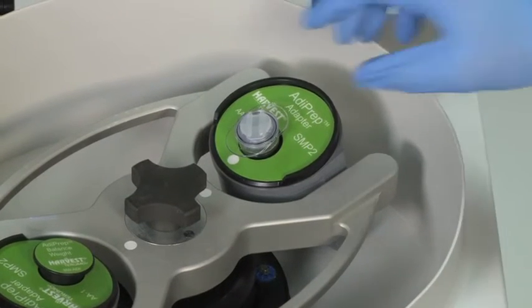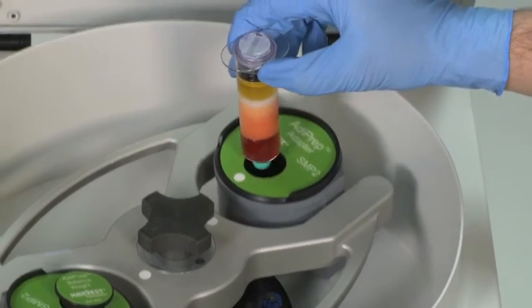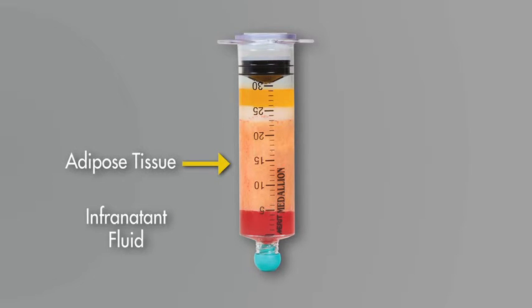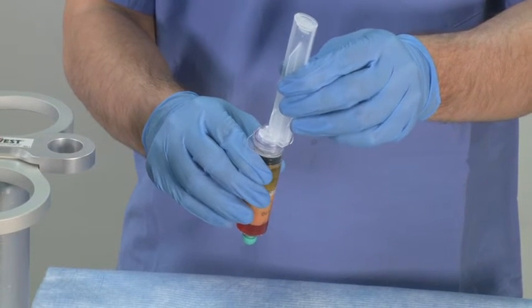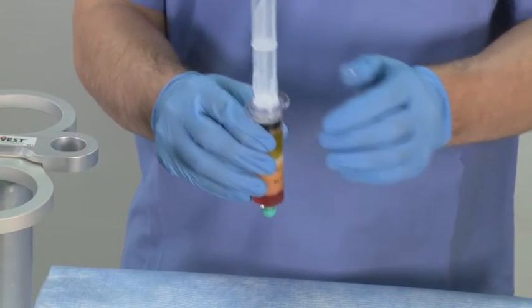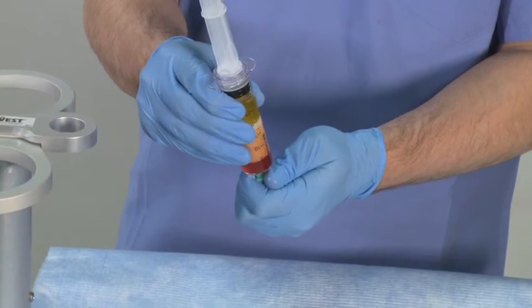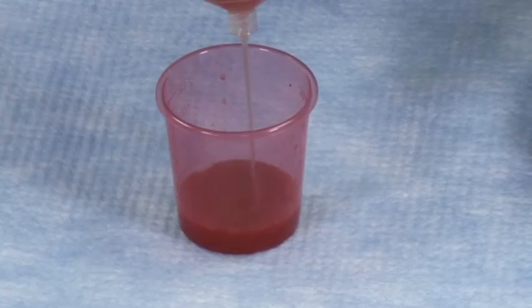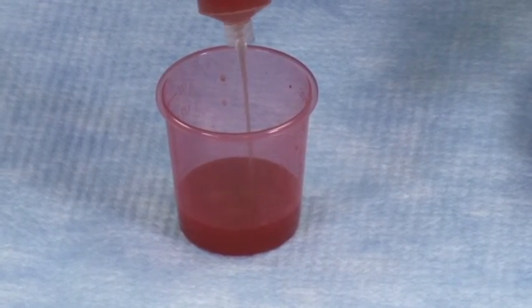Remove the process disposable from the centrifuge. The lipoaspirate sample will have separated into three discrete fractions: the infranatant fluid present on the bottom layer closest to the green tip cap, the concentrated adipose tissue present in the middle layer, and the lipids present on the top layer as a bright yellow fluid just above the floating lipid barrier disk. Reattach the syringe handle and remove the green tip cap. Expel the infranatant fluid into a disposable cup until the concentrated adipose tissue layer is reached. Be careful not to expel the concentrated adipose tissue out of the syringe.